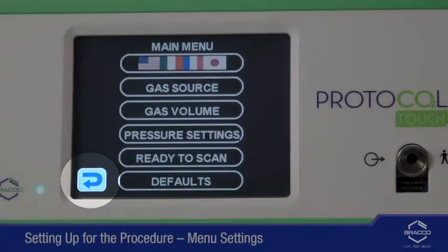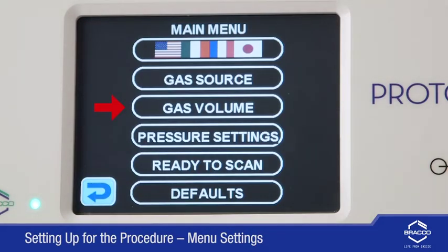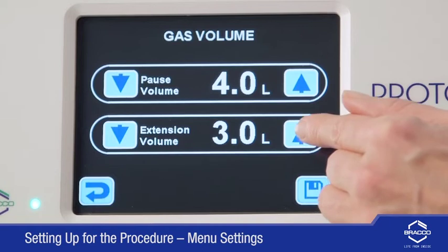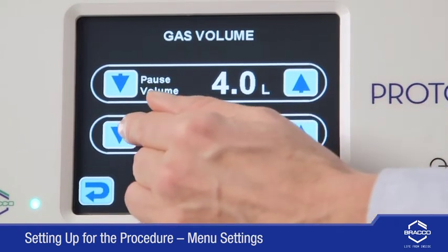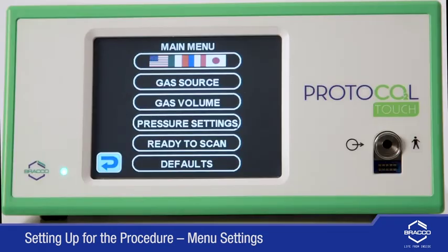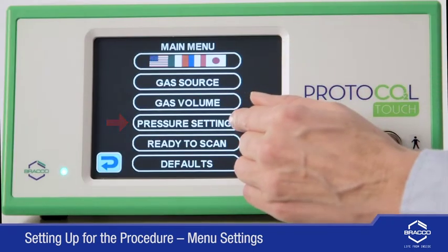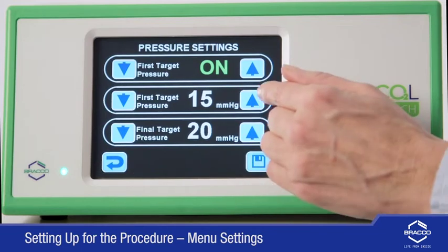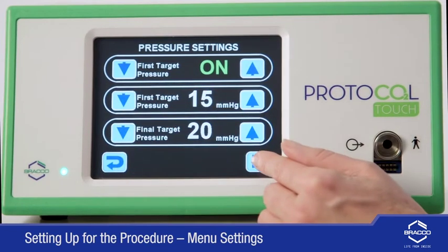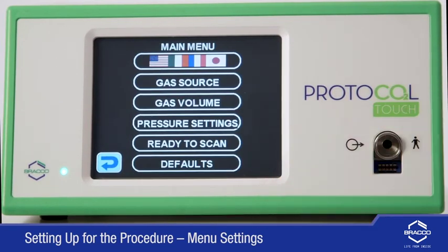Note, you can use the back icon on the lower left corner of the screen to exit this menu at any time. To select the gas volume, press the button and then adjust both the pause volume and the extension volume by pressing the arrows up or down. Press the Save icon to store the selection. Now select the pressure settings. Press the Pressure Settings button. Once in that section, you can select an adjustable first target pressure that the device will reach during the initial insufflation. Press the Save icon to store the selection.